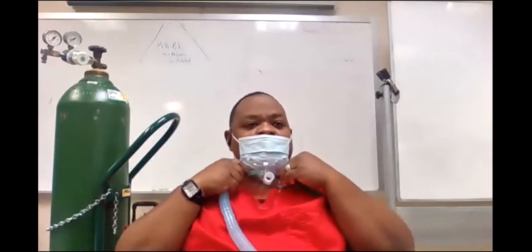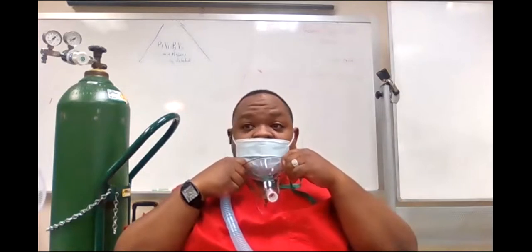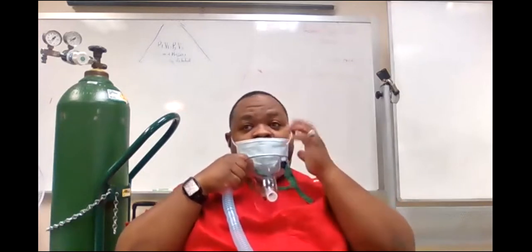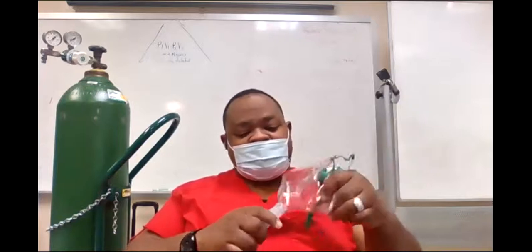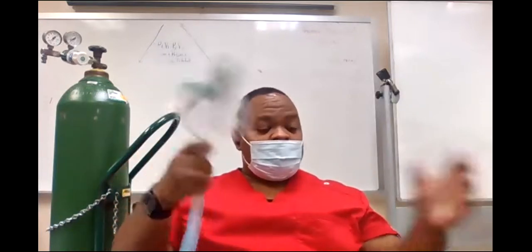It just hangs right here and the oxygen comes up like that so they can breathe it. If they just had oral surgery or gunshot or stab wounds in the face, you can't put nothing on there, right? You have to keep it off the face. So it's called a face tent. So if I put this on here, this is now an aerosol face tent, okay?